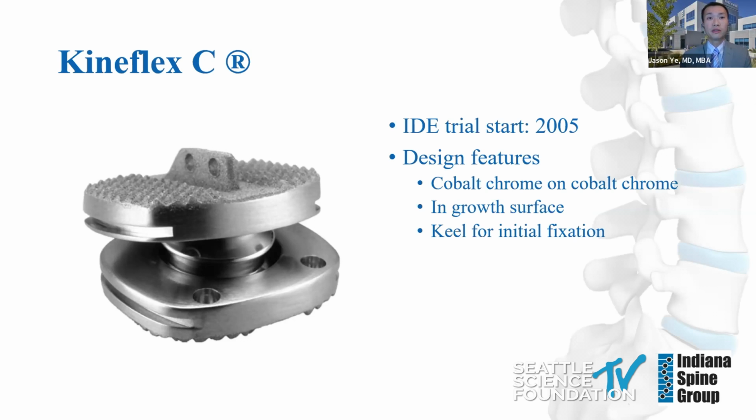In 2010, DePuy recalled their ASR metal-on-metal hip system due to metal wear debris. This had led to some severe inflammatory reactions as well as high serum cobalt and chromium levels. In this context, the Kineflex C never made it to market.